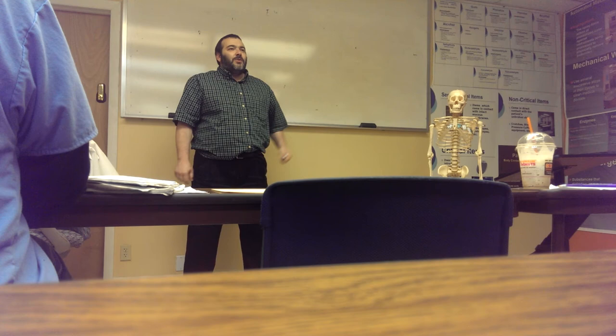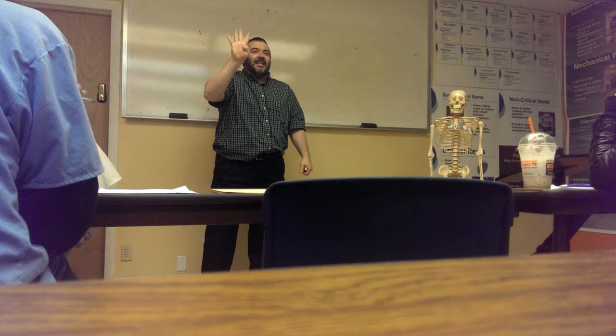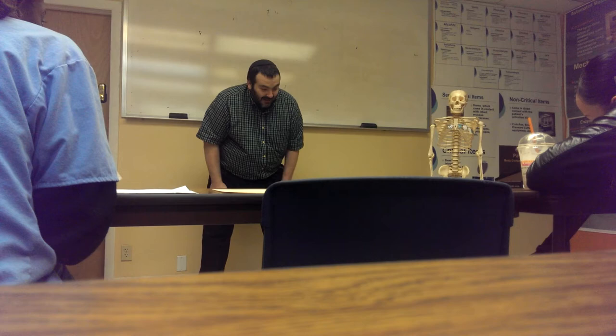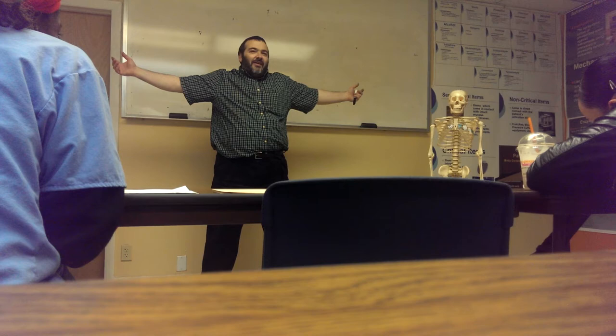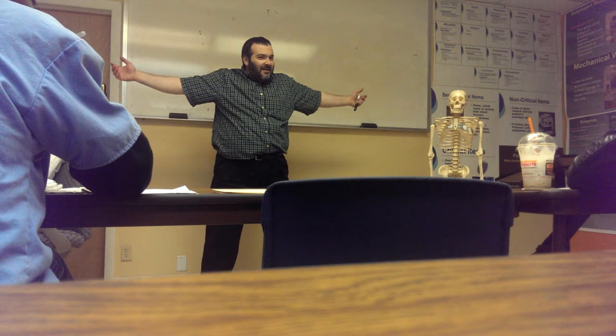How many views did we get? Six. One, two, three: AVR, AVL, AVF. Six from four stickies. Are we doing the math so far? So far, we just put things on arms and legs. Hey, I've been working since 6 a.m. this morning, all right? Work with me. So far, so good. Four stickies, six leads.